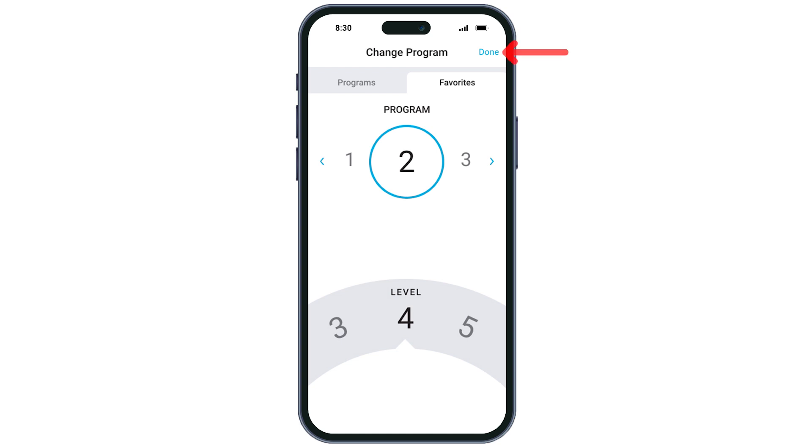When you have made all adjustments needed, tap Done and the changes will be saved. If you have any questions, please reach out to your Nevro HFX care team.